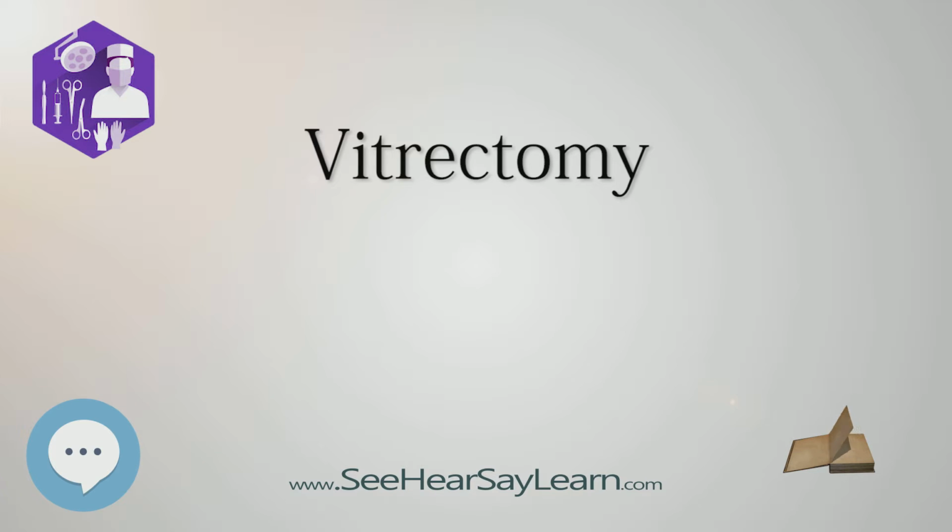When bleeding or retinal detachment occur, vitrectomy is employed to clear the blood, membranectomy removes scar tissue, and injection of gas or silicone with scleral buckle may be needed to return sight. Diabetics should have an eye exam yearly.